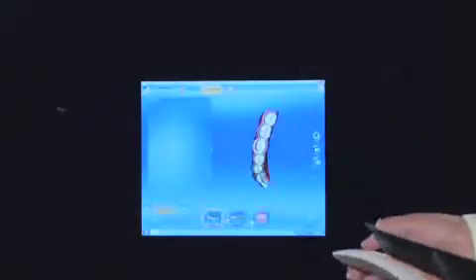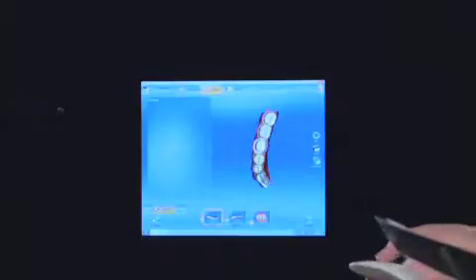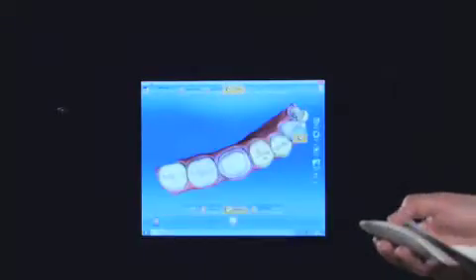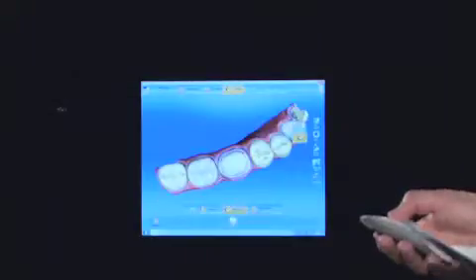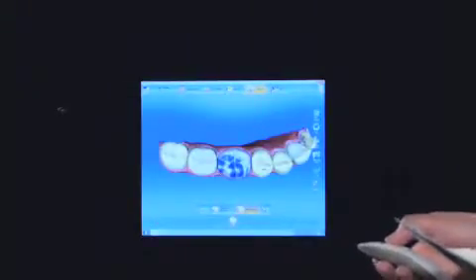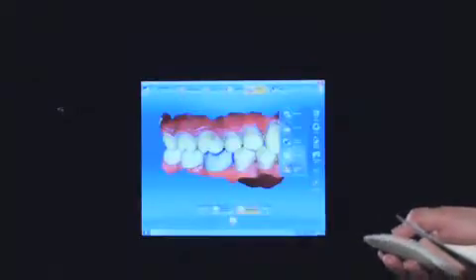This is the software where we've taken a scan — I've taken a scan of a model just as a demonstration — and here we've got an upper and lower scan with a bite, and we put the bite together to allow the teeth to come together in the correct position. Then you'll see I'm just marginating around the tooth, showing the computer where to put the restoration, and with one click we get this restoration made, which fits the bite. Quite amazing. Then we go to the milling machine and we put a block in and we mill away.